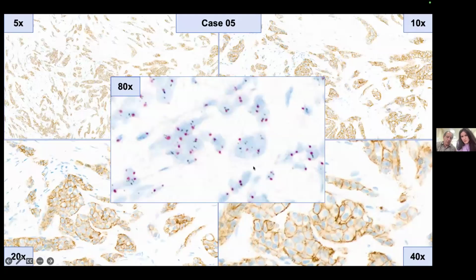So those of you that were tempted to say, "Oh, look, I can see membrane staining at times 5," which is correct. But is it circumferential? Ask yourself. Can you really identify 10% of the cells unequivocally, without bursting your eyes, with circumferential staining? Or would you think, let's play safe, let's do an ISH, let's call it 2+.